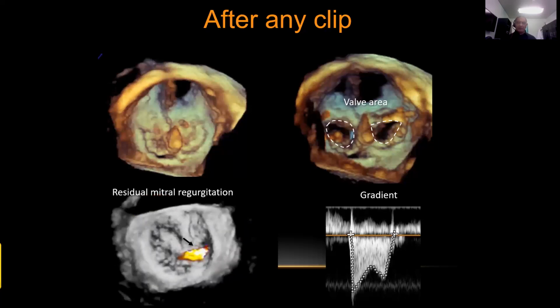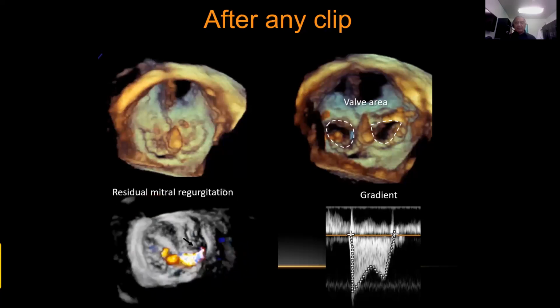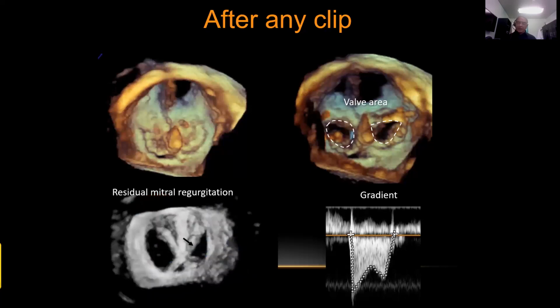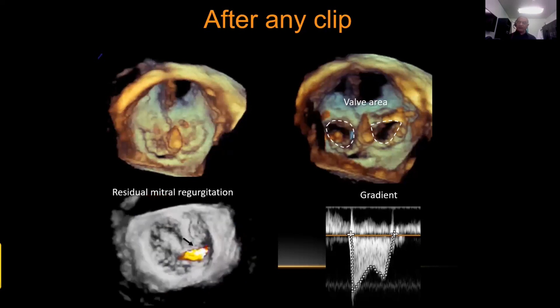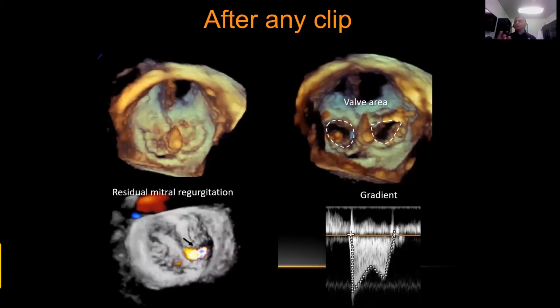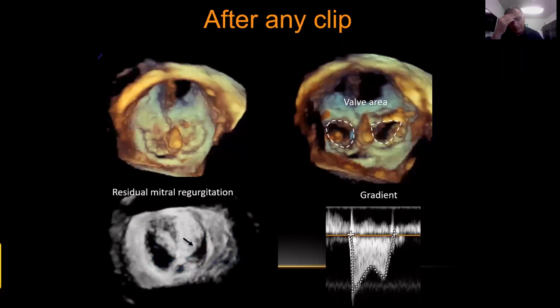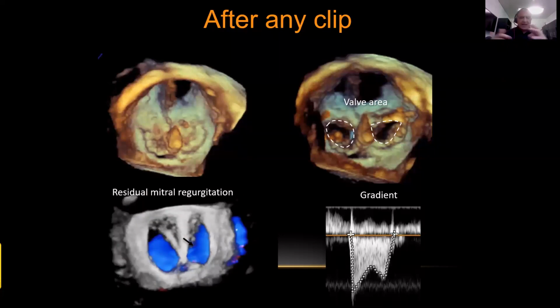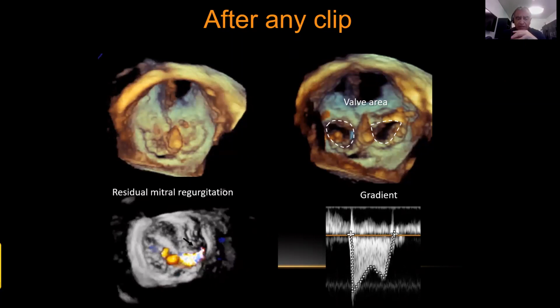For example, in a couple of cases, we had a complication where the second clip became attached to the chordae tendineae. It could not be closed anymore. At that time, I said, come on, we can stop with the first clip, and we can try not the second clip. But what do we do with my interventionalist?